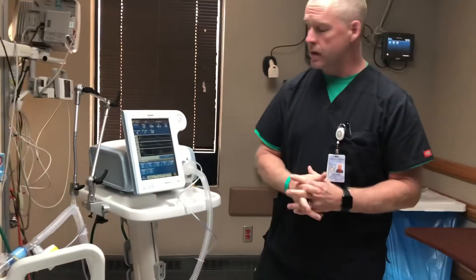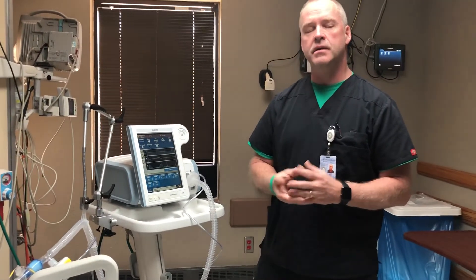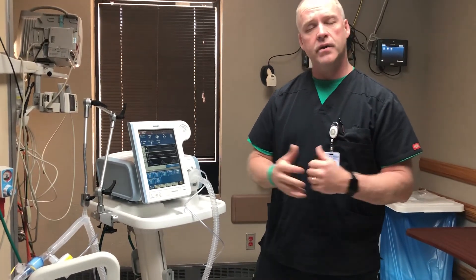And that's basically it for the overview. If you do have questions, contact the respiratory therapy department and ask one of the expert respiratory therapists — they'll be happy to answer any questions you may have. Thank you so much.